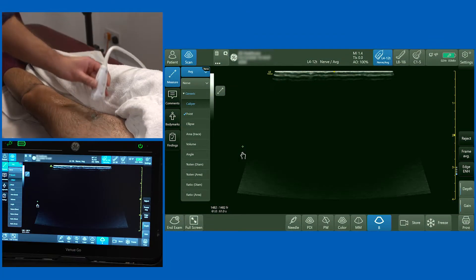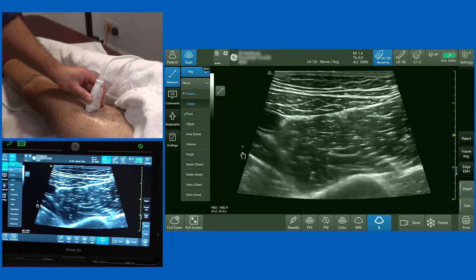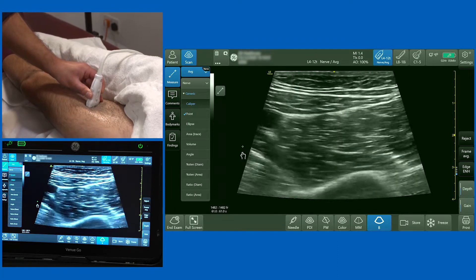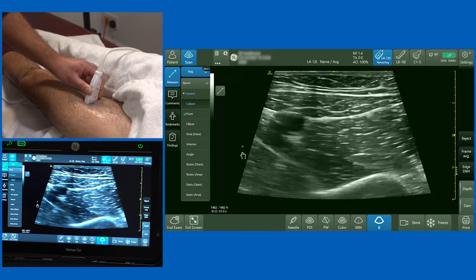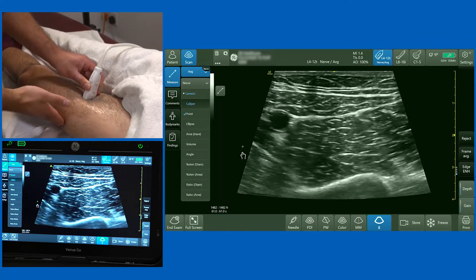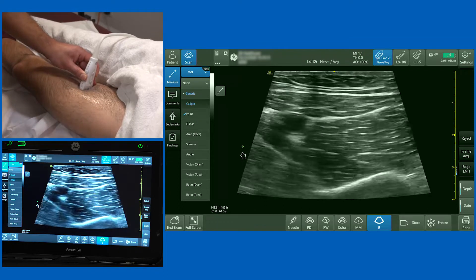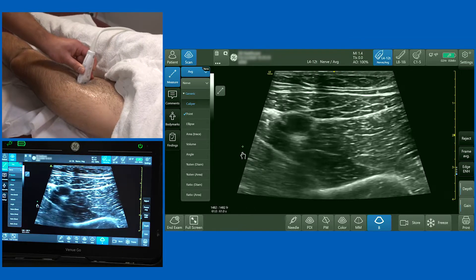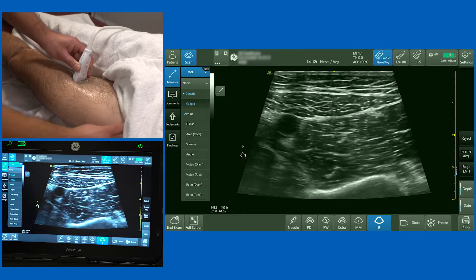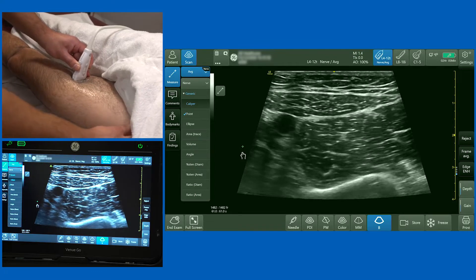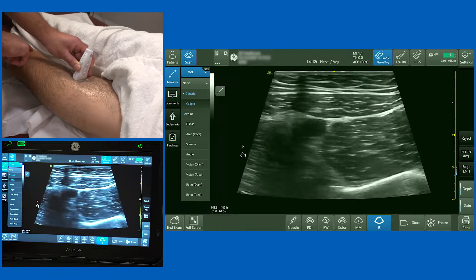We're now going to demonstrate the adductor canal block, a block that has become popular recently as a motor-sparing knee block for patients having total knee arthroplasty. I've got the hip slightly abducted and I'm placing a high-frequency linear probe utilising the virtual convex function in the mid aspect of the thigh. To orientate yourself, you've got the anterior superior iliac spine over here and the medial femoral condyle lower down here.